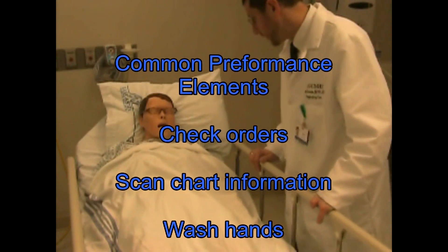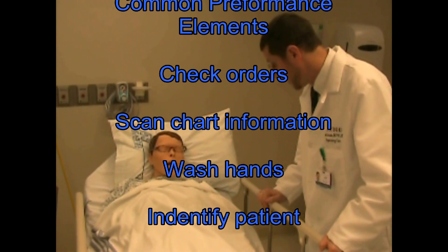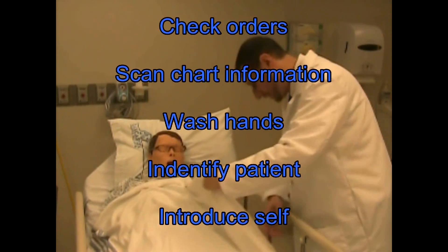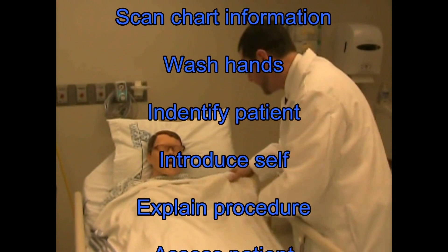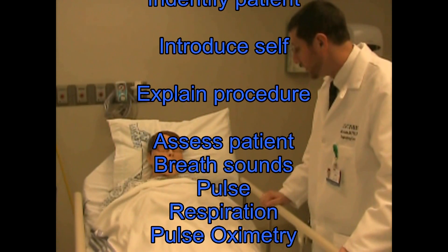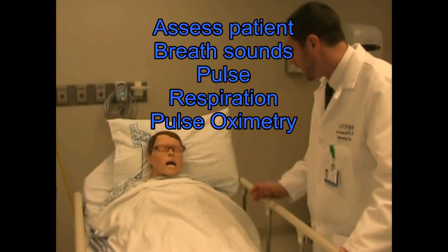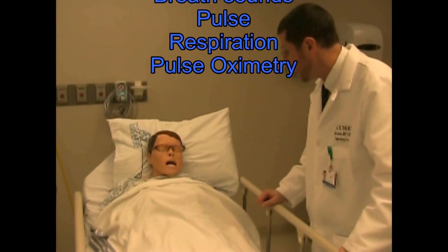Hello sir, my name is Jim from the respiratory department. I'm here for your breathing treatment this morning. May I just check your name band please? Excellent. I checked your chart before coming into the room. We're going to continue with the same breathing treatments that you had yesterday — same medication and same type of delivery. I'm just going to wash my hands and get your equipment together. I'll be right back.